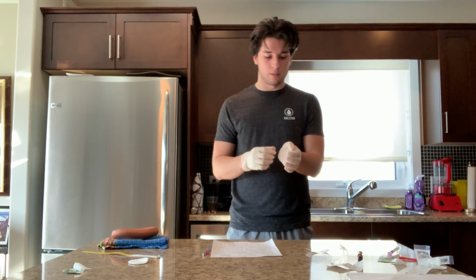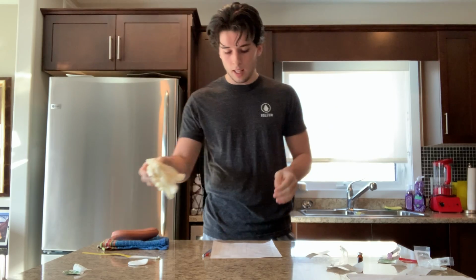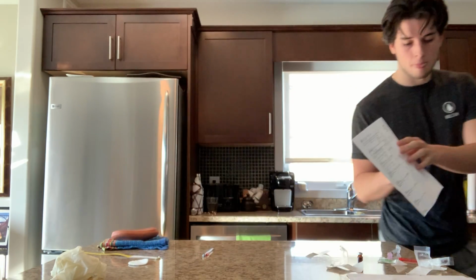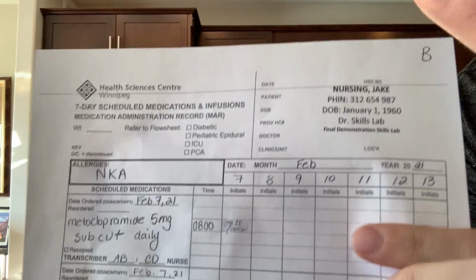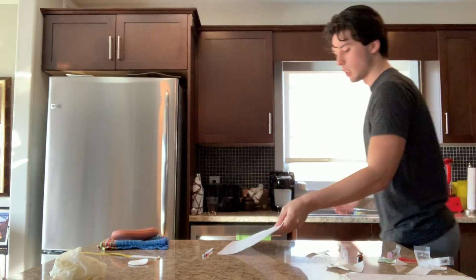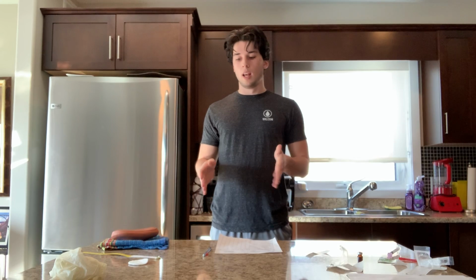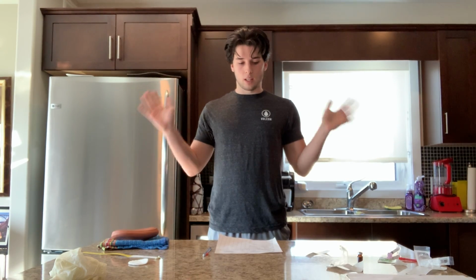And after, once I've documented, I'm also going to remove my gloves. I'm going to wash my hands. And then once I have documented that I did sign off my proper medication in the right time and right slot, I'm ready to do my final exit safety check. So I'm going to make sure that the patient is in a safe, comfortable position with the call light in place, the bed lowered, and that there are no hazards in the way. And in this case, we're all good. And then once I have done that, I'm going to go document in the MAR how the patient tolerated the procedure, their levels of nausea, as well as their vital signs. And once I have documented, that's the end of the procedure.